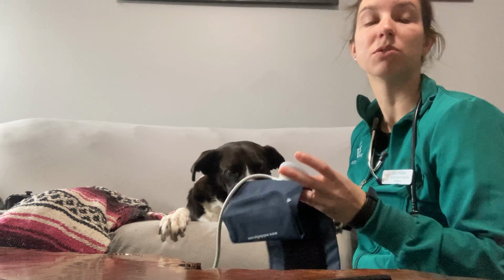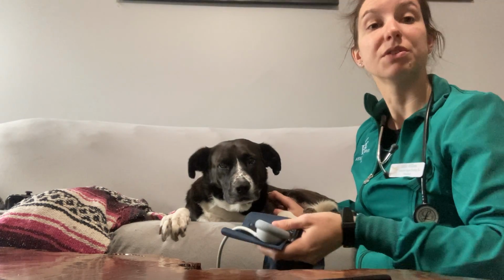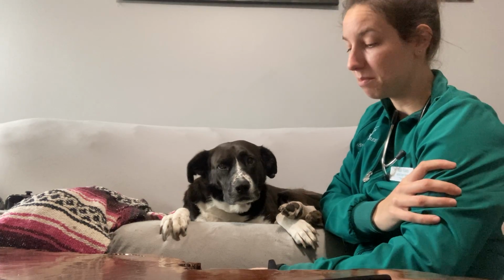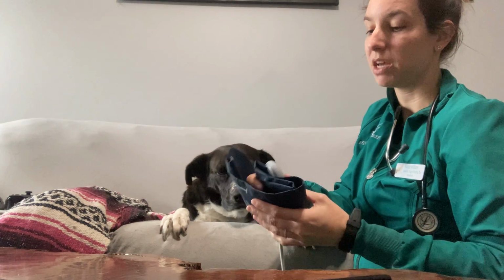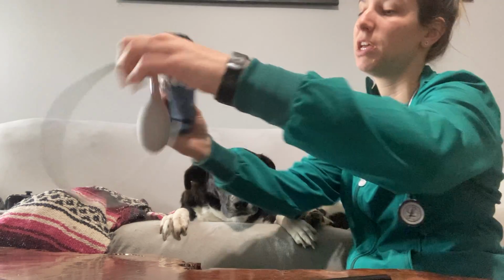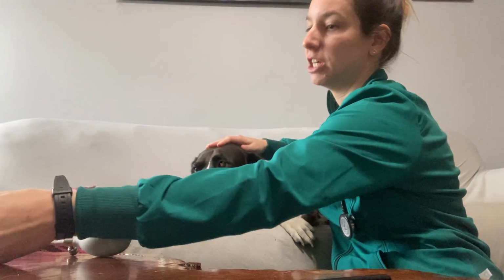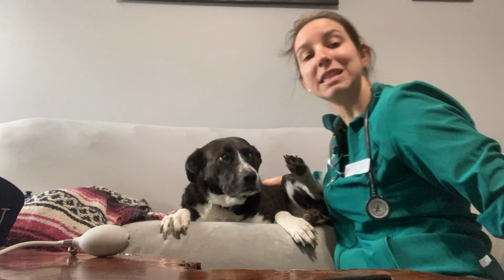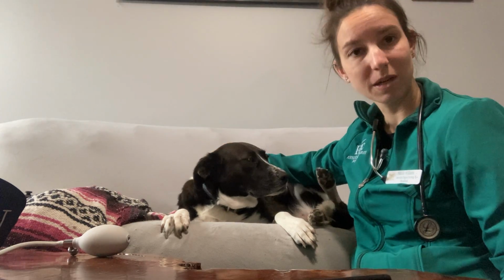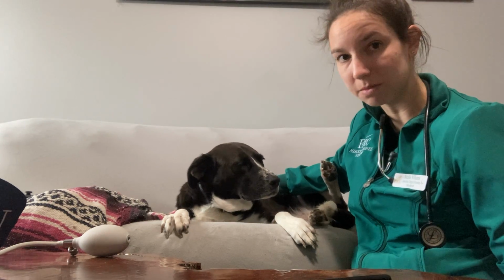Typically, cuffs are supposed to encircle about 40% of the upper arm. It's supposed to fit snug but not too tight and fit around the bicep. When we listen, we pump the cuff up to approximately 30 millimeters of mercury above the expected blood pressure. We let it out and deflate the cuff at a rate of about 2 millimeters of mercury per second so that we don't go too fast, so that we can ensure the most accurate reading possible.